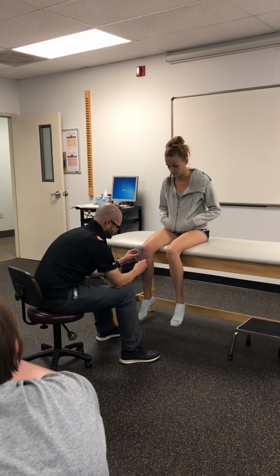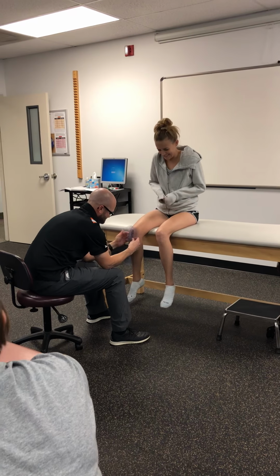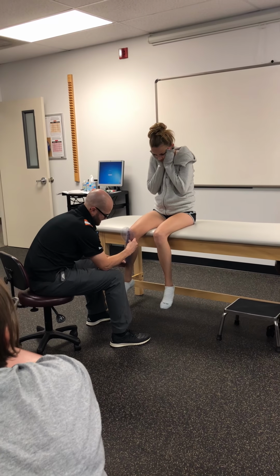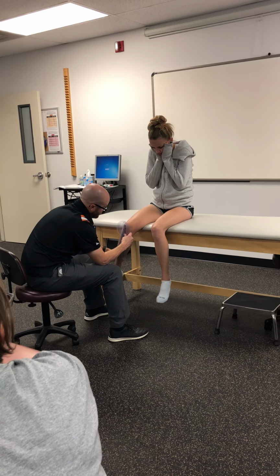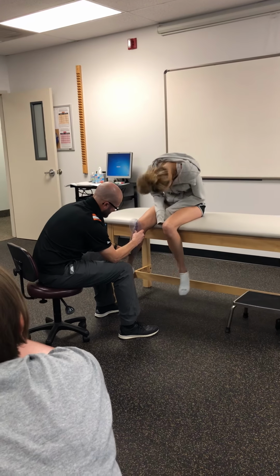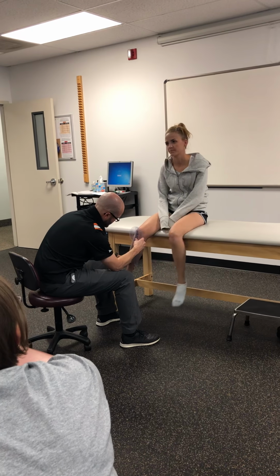Okay? So, you lined up here. And let's say, what? 18. 18, is that what you're saying? Okay. So we want to do some internal rotation. So I can grab her leg, keep that proximal arm perpendicular, up, down, and that's seriously as far as I'm getting. Right there. That is terrible. But at the same time, kind of what I would expect for a dancer. How come? Because they all do external rotation.